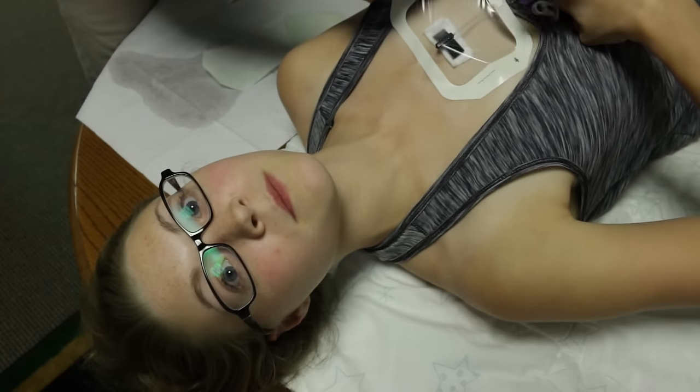Start at one edge and slowly remove the paper perimeter backing of the tegaderm, pressing down the edge as you go — if you don't press it down right away it has trouble sealing. Work all the way around. And there it is — voila. At this point sterility is no longer required because Mary is fully covered.